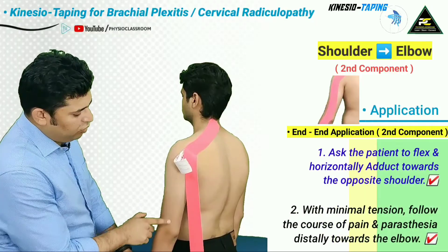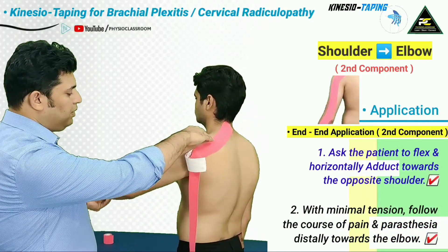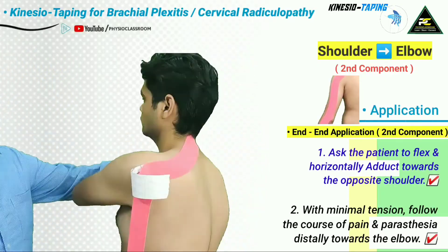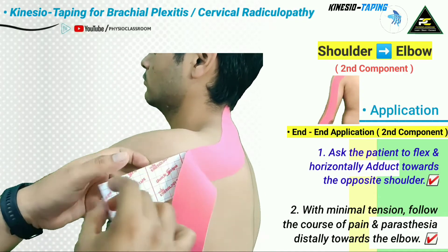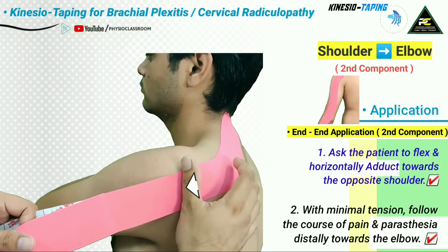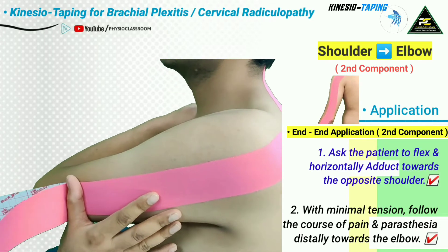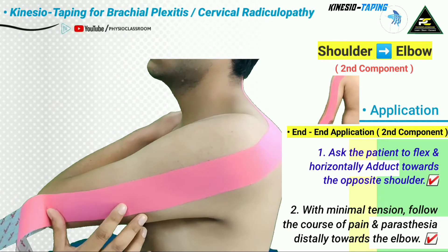To stretch the overlying skin for the second component, the patient is asked to flex the shoulder and then horizontally adduct it so that the hand reaches toward the opposite shoulder. Once the skin is stretched, the paper backing is removed and with very minimal stretch, the tape follows the course of the pain and paresthesia up to the elbow joint, stopping there.